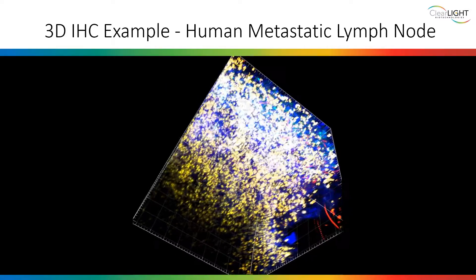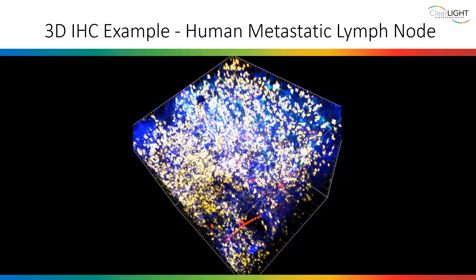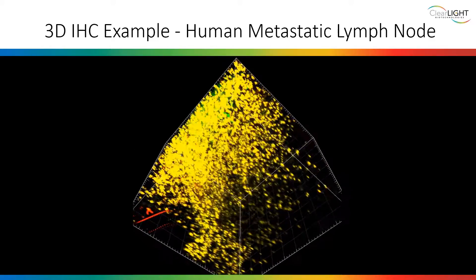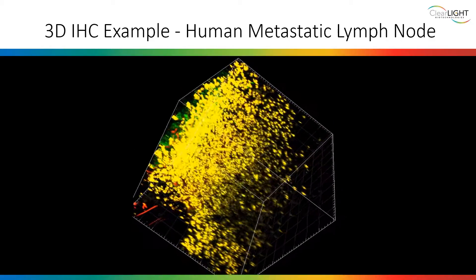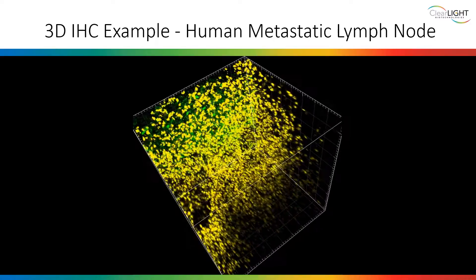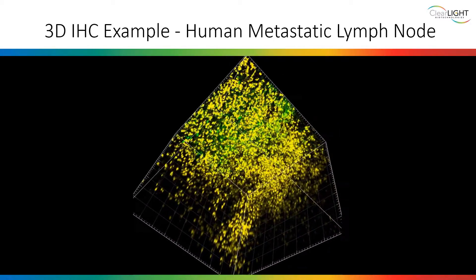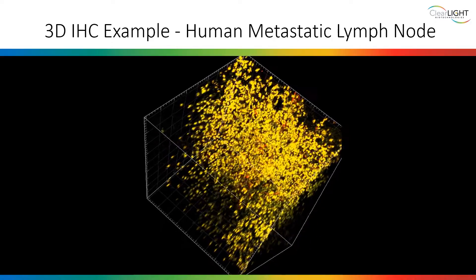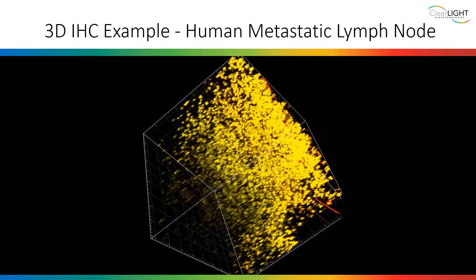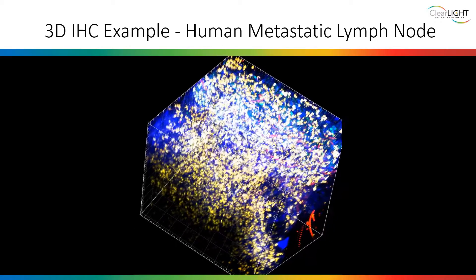In another example, this is an image of a human metastatic lymph node associated with a stage 2a non-small cell lung cancer adenosquamous tumor. Pan-cadherin, a cell adhesion marker, was used to observe tumor cells, while CD8 denoted the cytotoxic T-cells. Alpha-smooth muscle actin was used as a marker for the stromal cells, and DAPI was used as a nuclear counterstain.